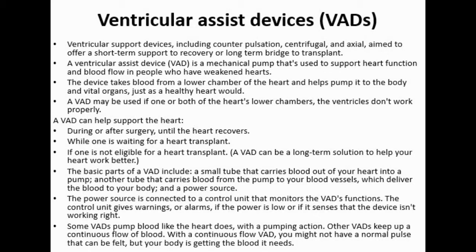On today's video, we will be talking about ventricular assist devices, which are also named as VADs. A ventricular assist device is a mechanical pump used to support heart function and blood flow in people who have weakened hearts. The device takes blood from a lower chamber of the heart and helps pump it to the body and to the vital organs, just as a healthy heart does.